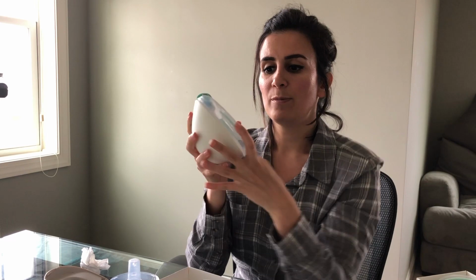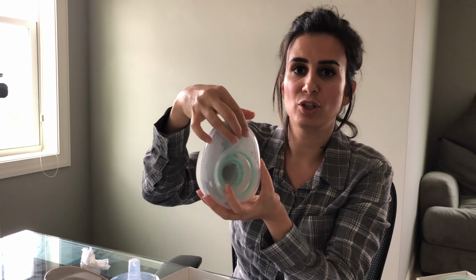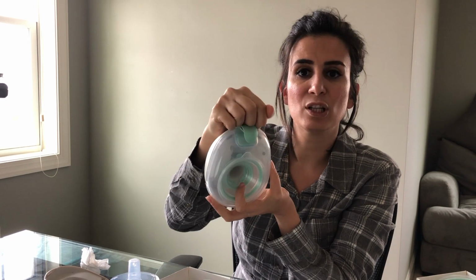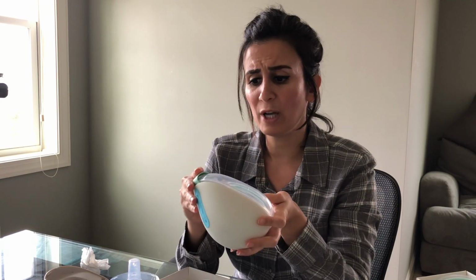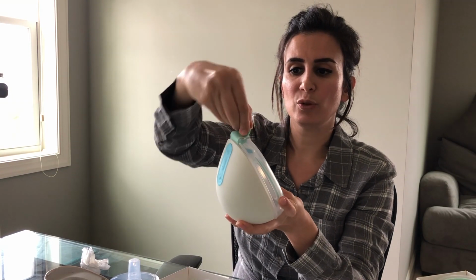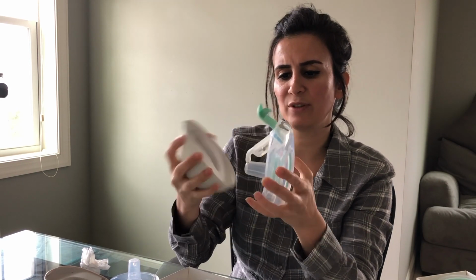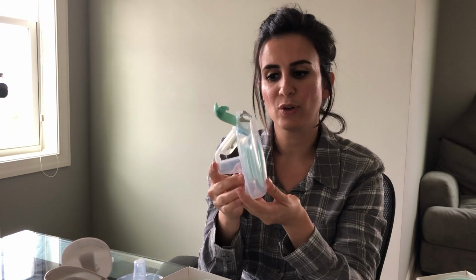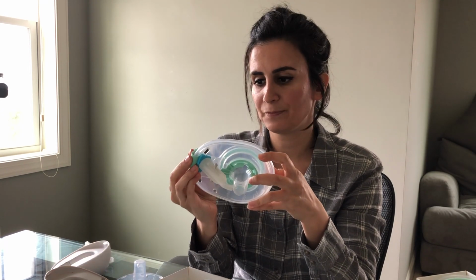Now when it comes to pumping and then being done, you want to make sure that you turn that dial to 2. The reason for that is you want to close that vent hole before you do the flip to finish, because you do not want to lose your milk. Now when it comes to emptying the milk, you take this vent off, and then obviously you want to just take it off after you flip to finish, and then you just empty your milk. And I can show you as well, when there's milk in here, how to do this exact process.